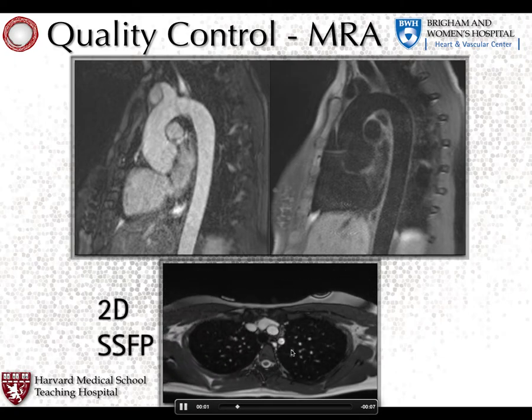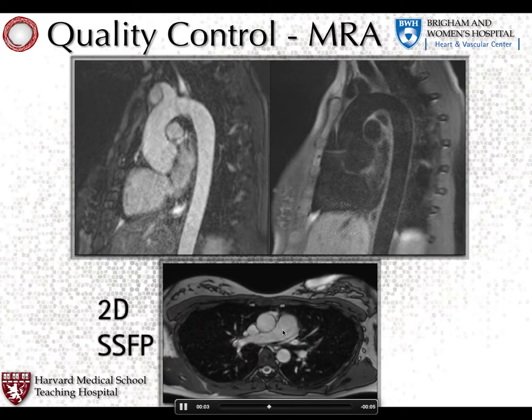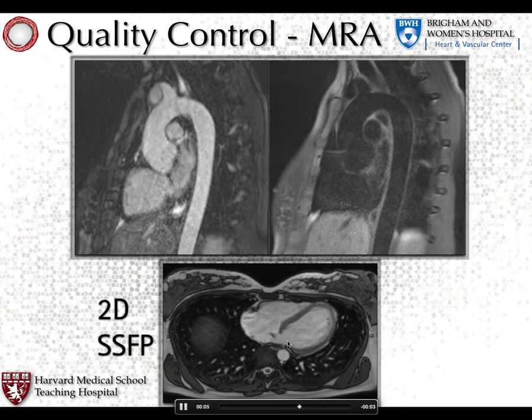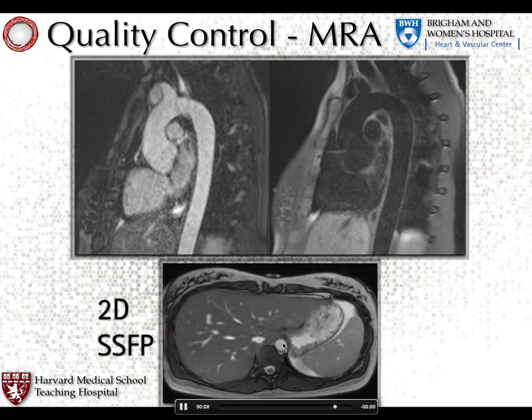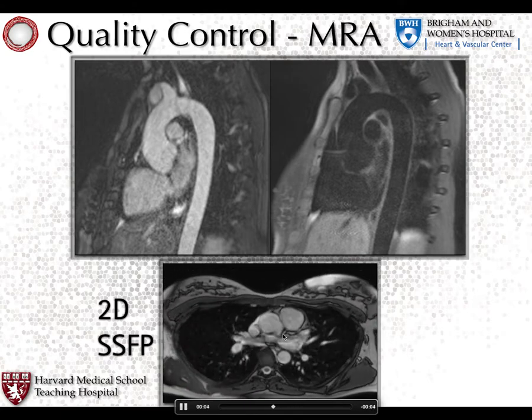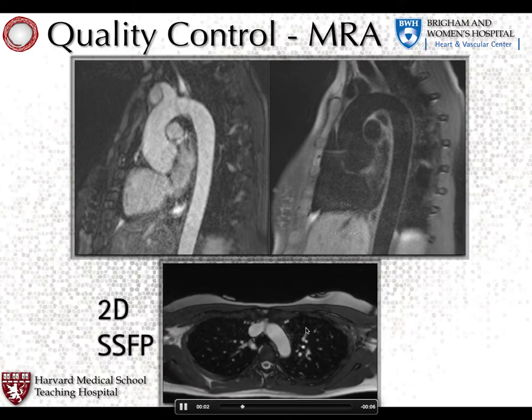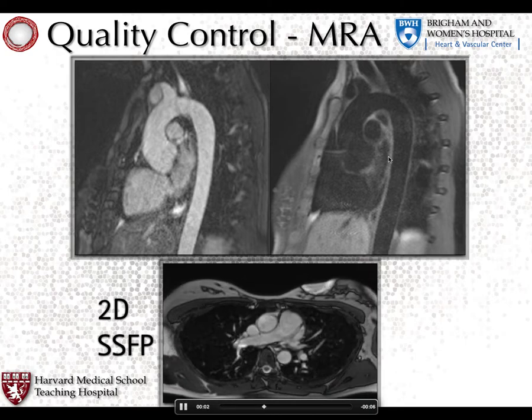You will see the patient breathe, but notice you don't see blurry motion when the patient's breathing. So this is a great technique, and it's really easy to get. You don't even need gating to do this. Any tech should be able to get this done on any patient without the need for breath holding. You can even do this without gating. These two techniques do require gating.